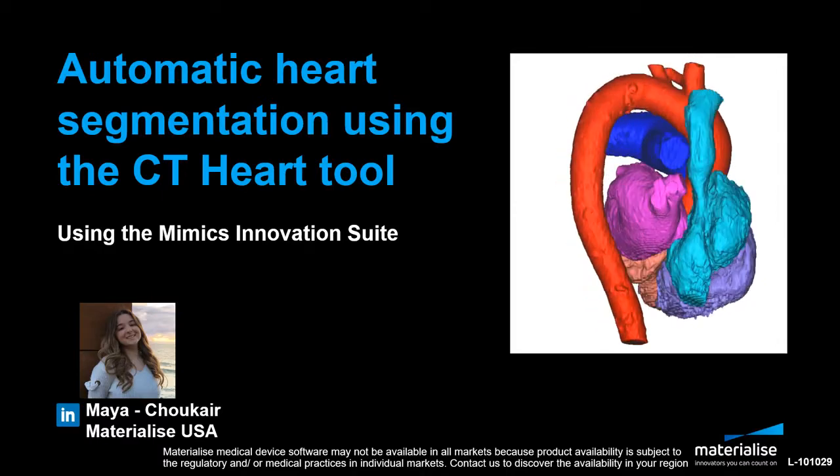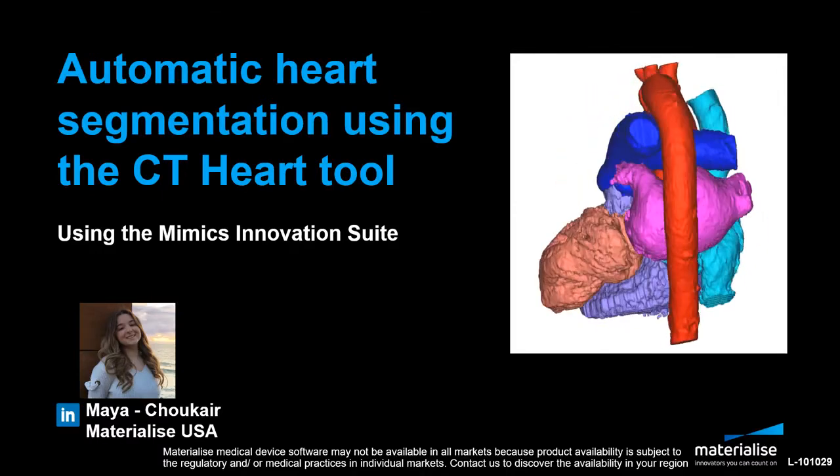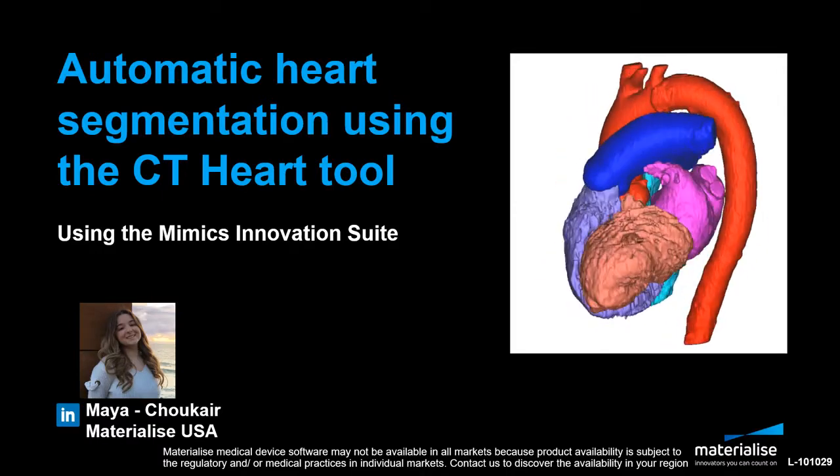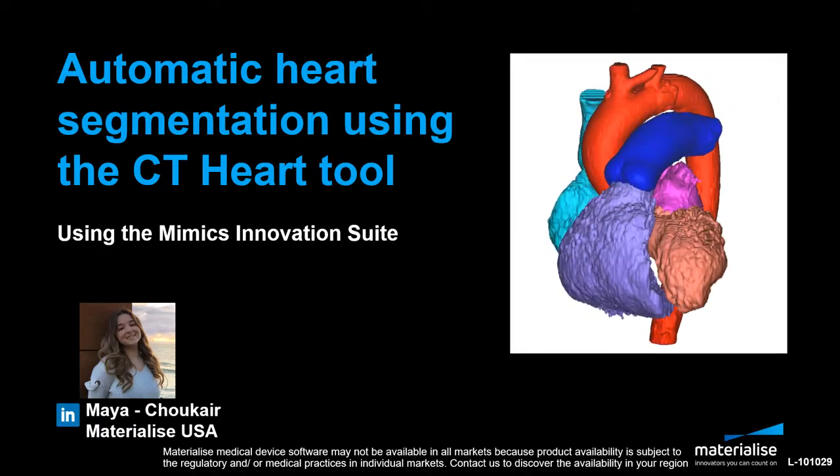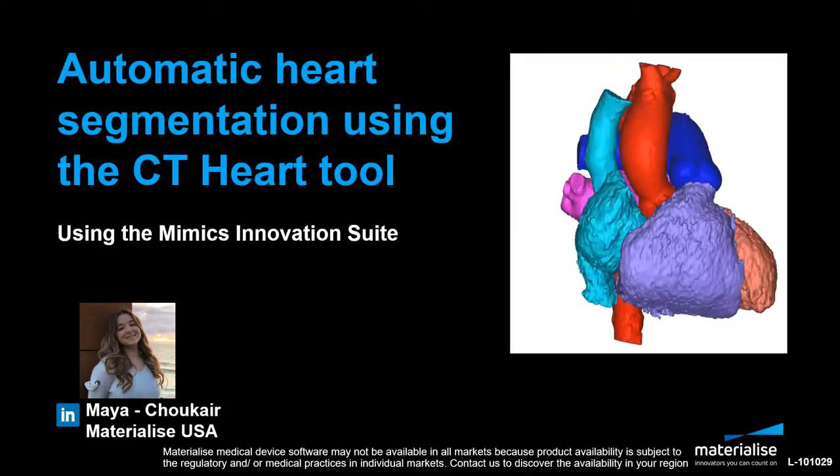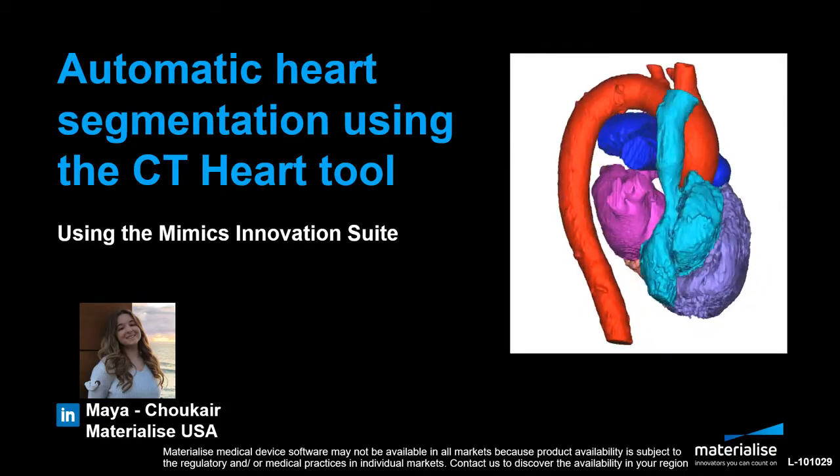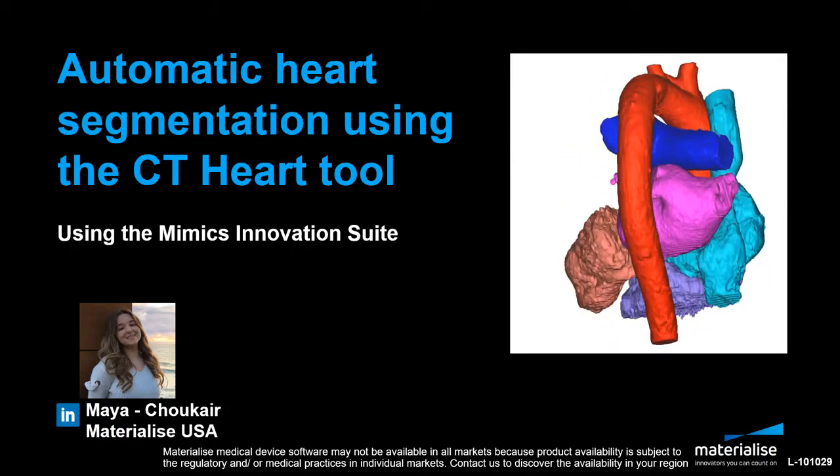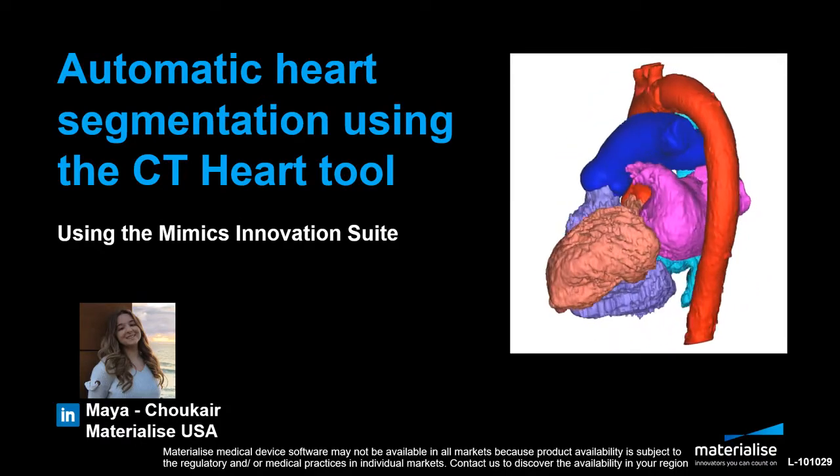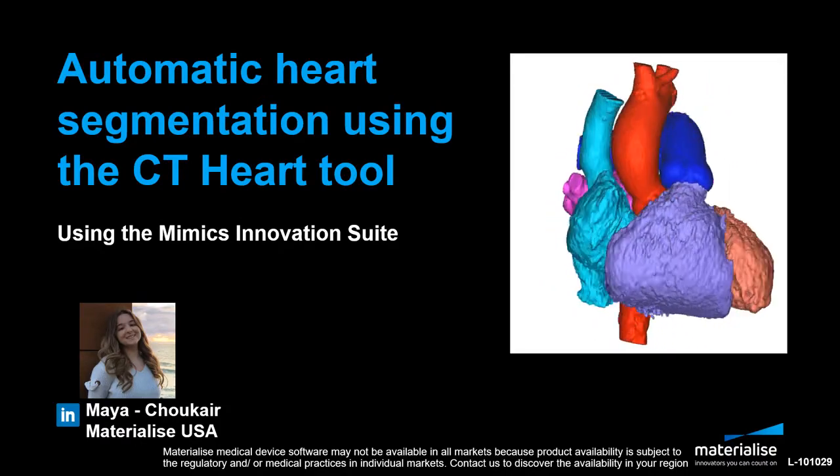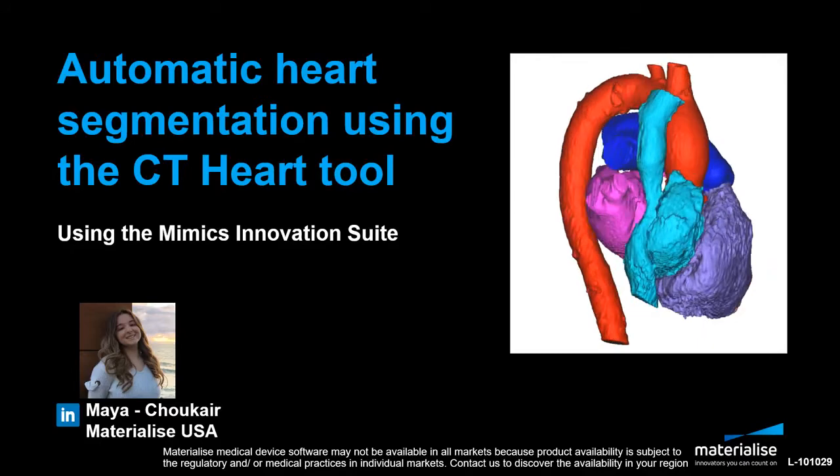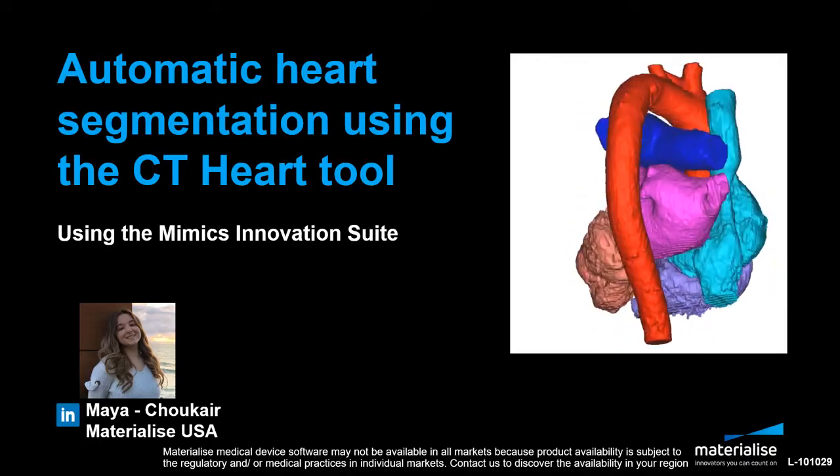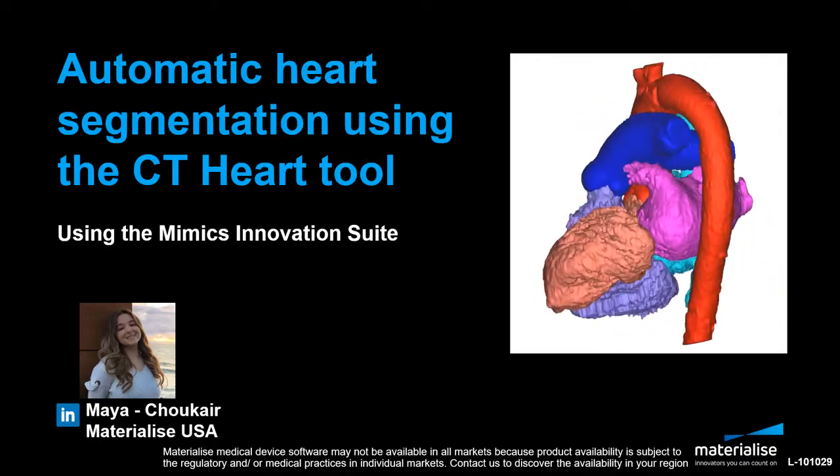It's important to always find better and faster ways to speed up your workflow, especially in a clinical setting where the number of segmentations needed of the heart might be high in volume and require accuracy.